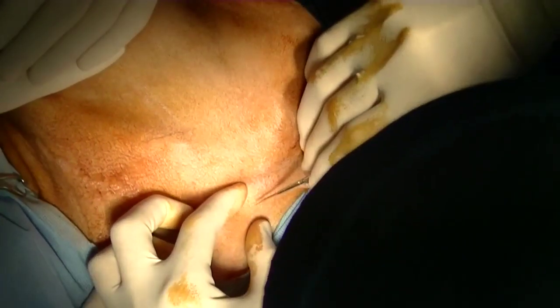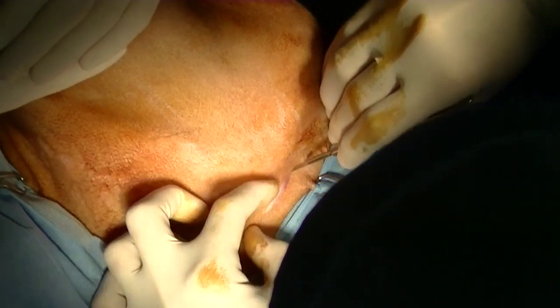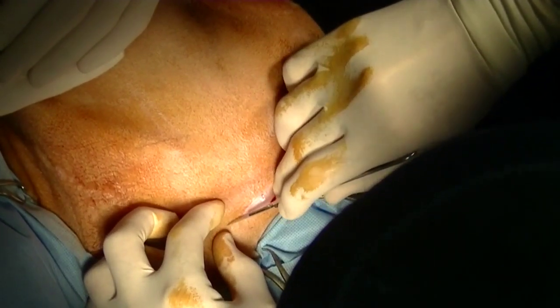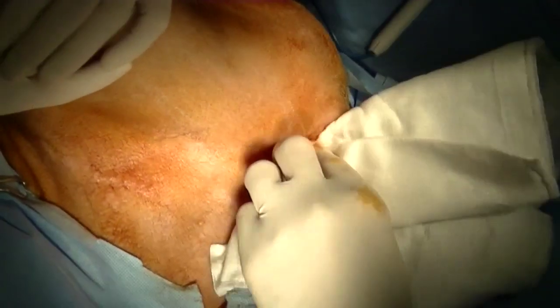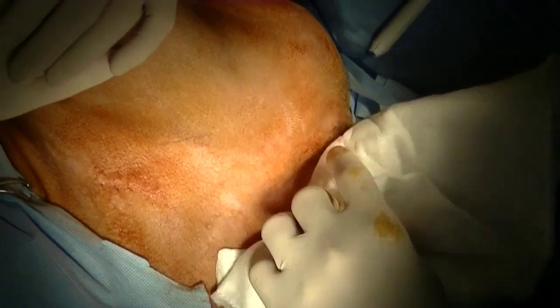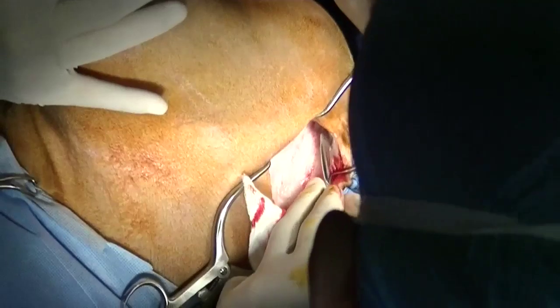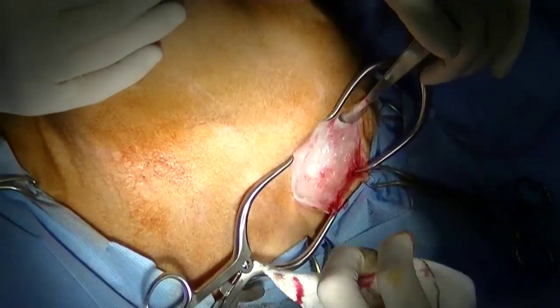The first thing we do is a midline pubic incision. We're doing this surgery bilaterally — on both hips — through only one pubic symphyseal cut. The muscle is separated and then Hohmann retractors are used at the caudal and cranial extents of the pubic symphysis.